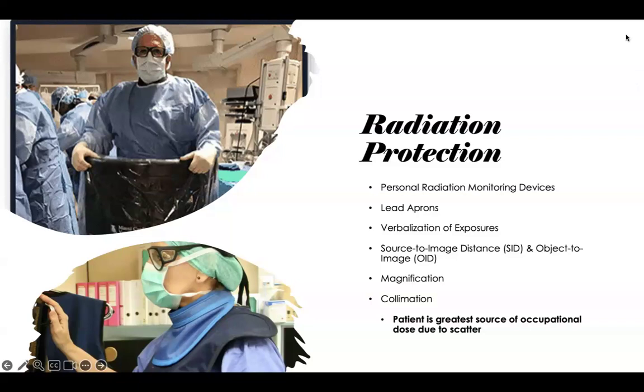Being mindful about magnification. With magnification, does anybody remember, when we use magnification, what happens? What three things increase when we use the mag mode or magnification?